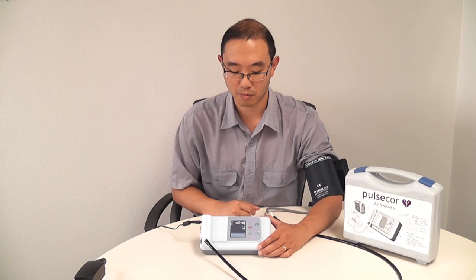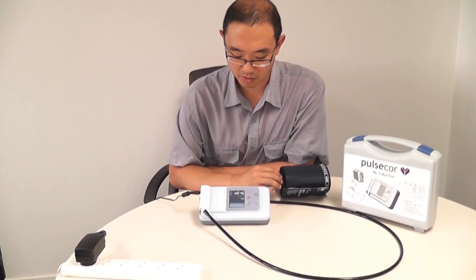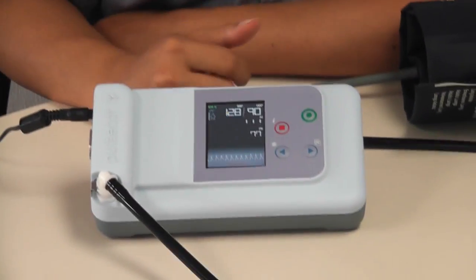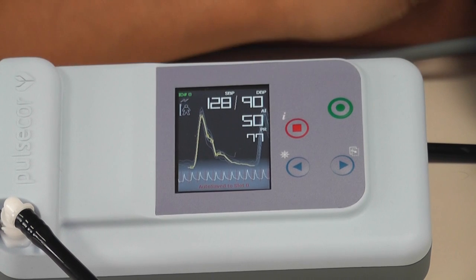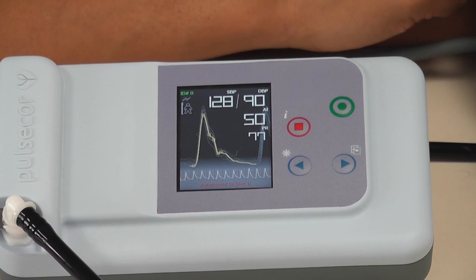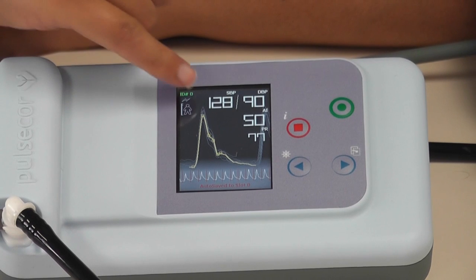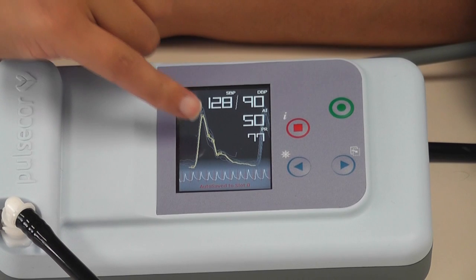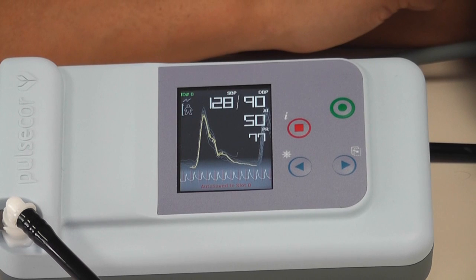The measurement has now completed. I can take this cuff off. It's measured my blood pressure at 128 over 90. My pulse rate is 77. You can see down here the rhythm strip, which gives each individual heartbeat. It also calculates an average waveform, which is the shape in yellow. It calculates an augmentation index of 50% — that's a peripheral augmentation index. You can see the incident wave here, which is the wave directly into my arm, and also the reflection wave, which is that little indentation buried in the side of the incident wave.